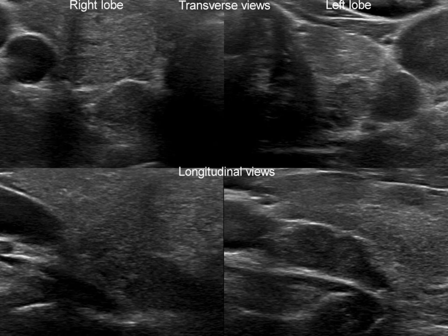Although their localizations are similar, it is evident on longitudinal scan that the right lesion, marked with yellow arrows, is within the lobe, while the left one, marked with red arrows, is outside the thyroid.